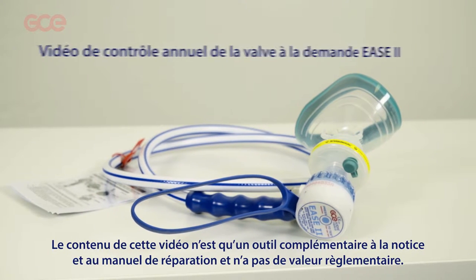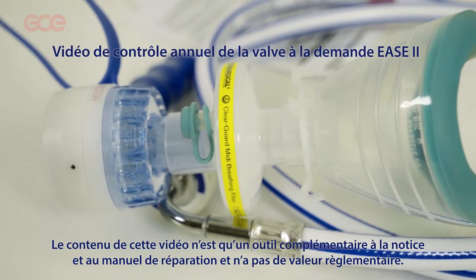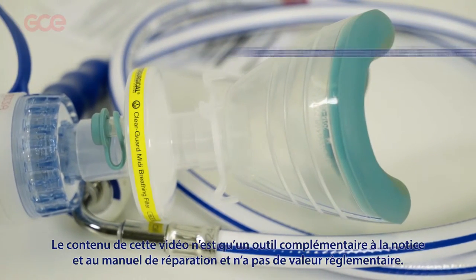The content of this video is only a supplement to the instructions for use and the service manual and is therefore not mandatory.